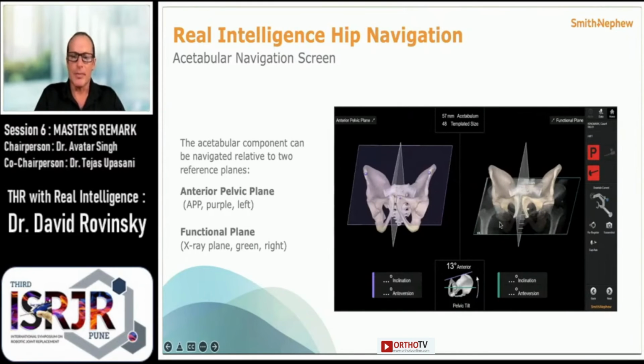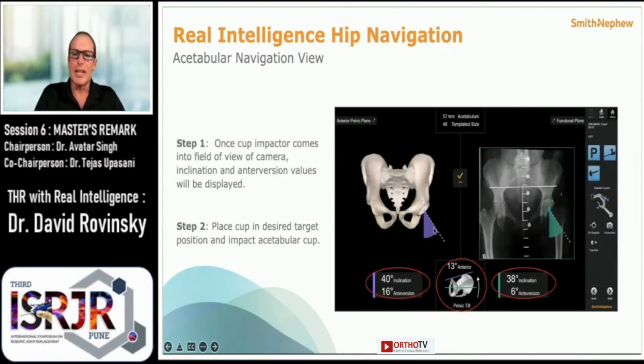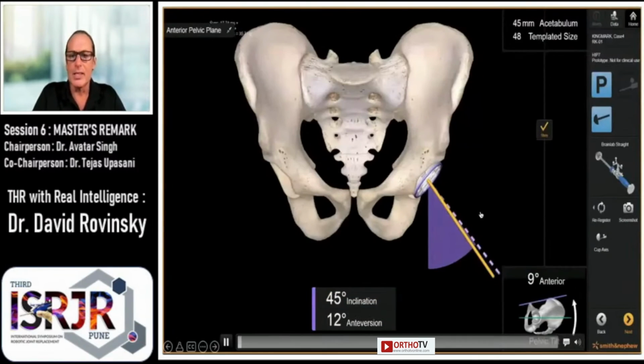the table. And what you'll find is that if you're using a navigation relative to the anterior pelvic plane, the numbers will look more familiar. But when you start doing your calculations involving the pelvic tilt of the patient, then your numbers will look less familiar, but then you can navigate relative to a virtual x-ray. And this is an actual screen.